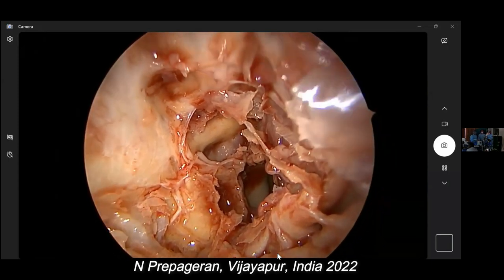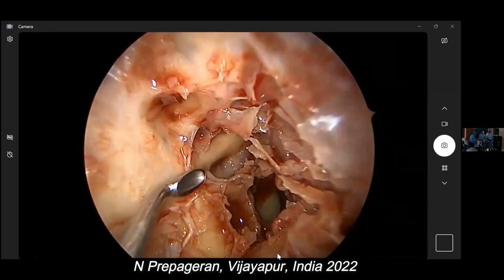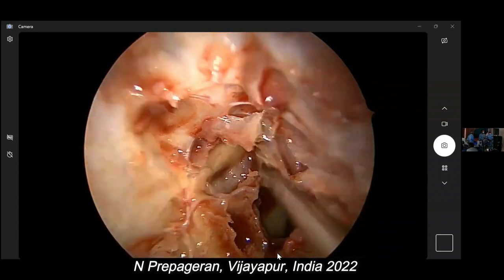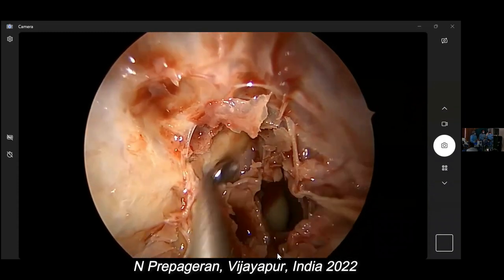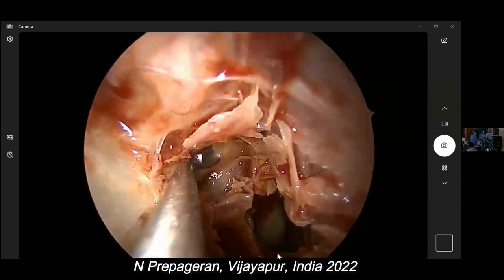We're going to do an optic nerve decompression. So to do an optic nerve decompression, what you need to do is put your curette into this bone and then follow it backwards. Can you see? There. Optic nerve decompression done.